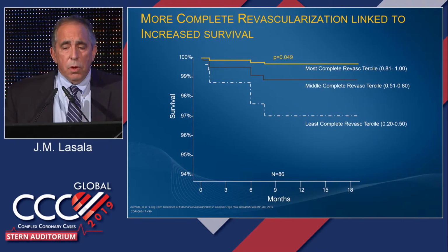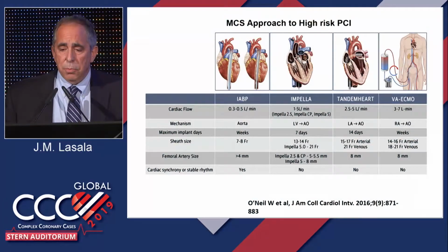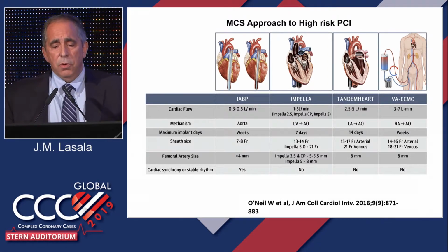And we're trying to compete with surgical type approaches, as has been mentioned previously. Without complete revascularization, we don't have that capability. And so the more we can potentially revascularize, the better our survival is. And these people that are impaired in this situation and complex anatomies, like we see Dr. Keeney and Dr. Sharma do today, may not be feasible to obtain that goal without some degree of hemodynamic support. So what they can do, this is a nice compilation, sort of side by side.